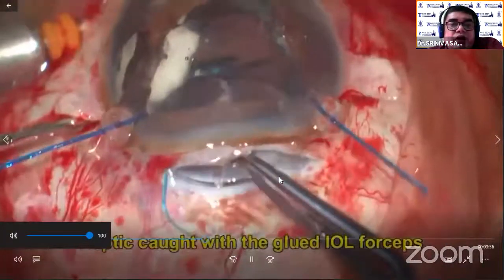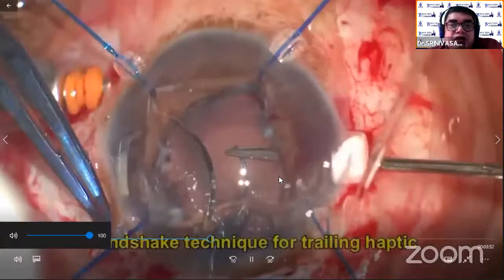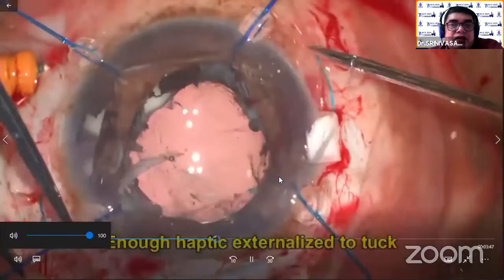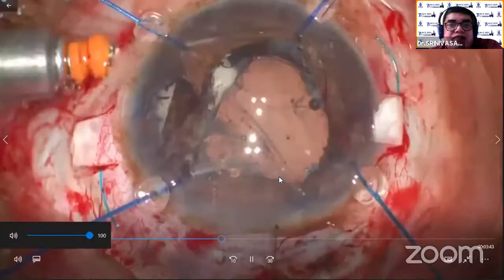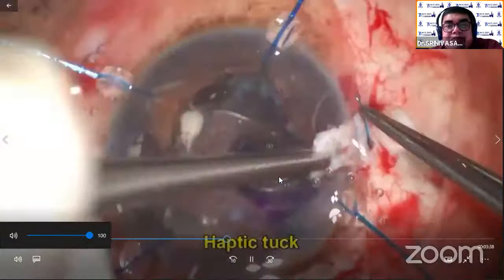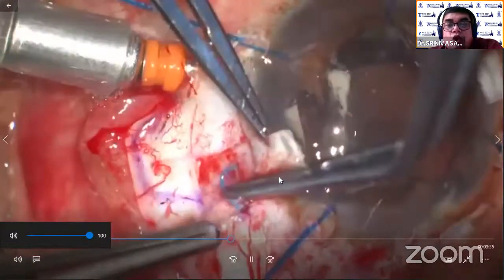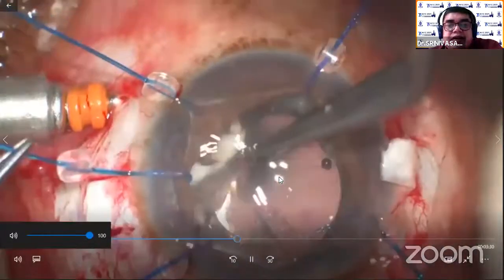Now I'm doing the glued IOL technique. Here, first the haptic is externalized. I also had a lot of learning curve when doing the glued IOL. Both haptics have to be externalized so that the lens is stable; otherwise sometimes the haptic falls down and is difficult to catch later. Creating the scleral pocket — always measure it and create that, otherwise later you can have what appears like a dislocated lens even if you are doing a glued IOL. The scleral pocket is created.